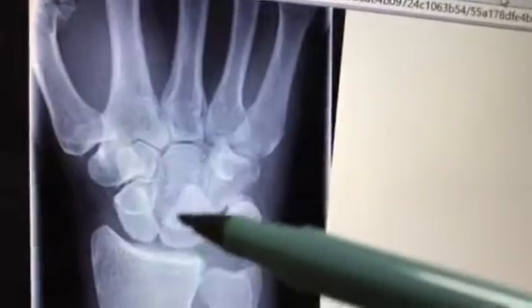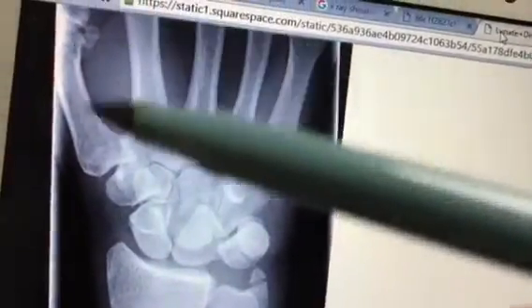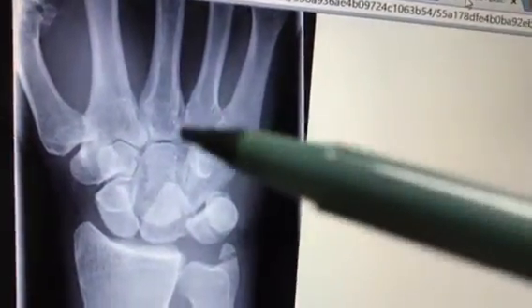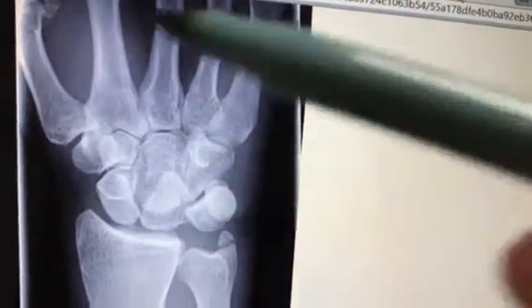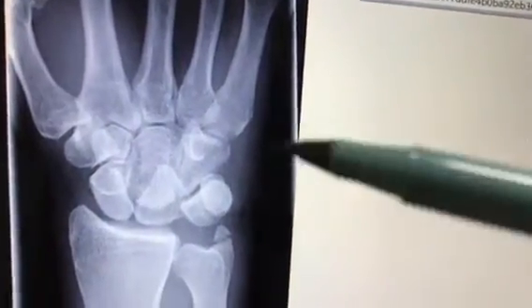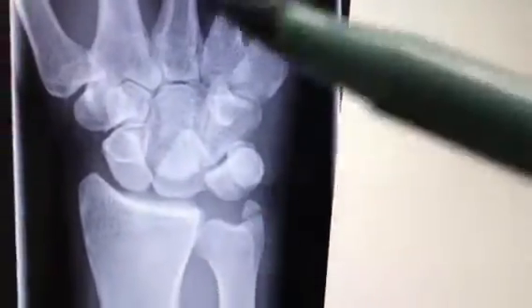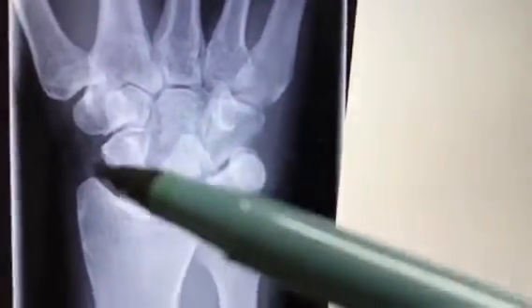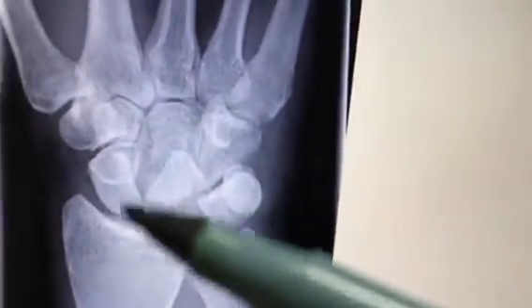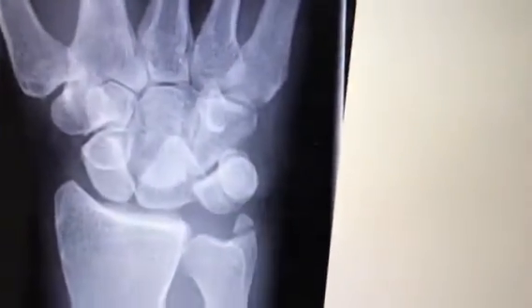The next X-ray is a plain X-ray, AP view of the wrist joint. The radius and ulna are visible, but importantly, the ulna never takes part in the formation of the wrist joint — this is a key point to mention. Then identify the carpal bones.